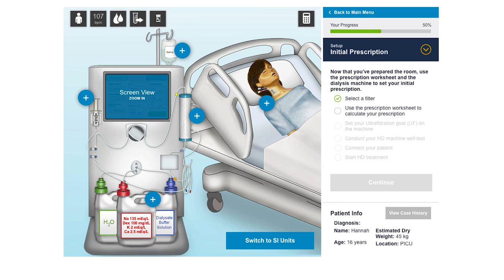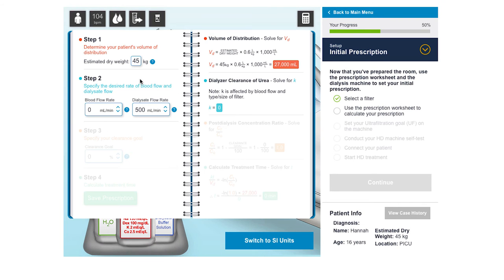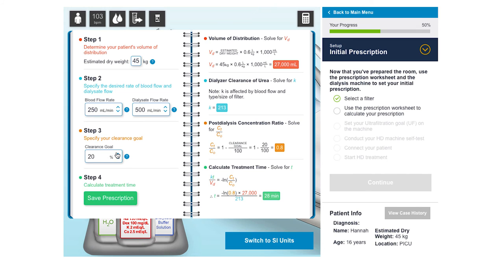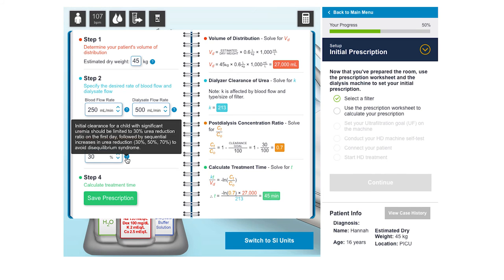In the second activity, the learner is guided through the steps of calculating a prescription. Hints are available to help, and again, action and case feedback is given.